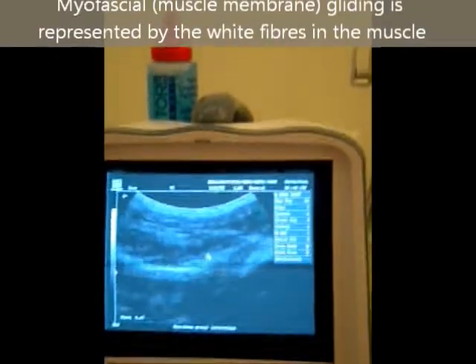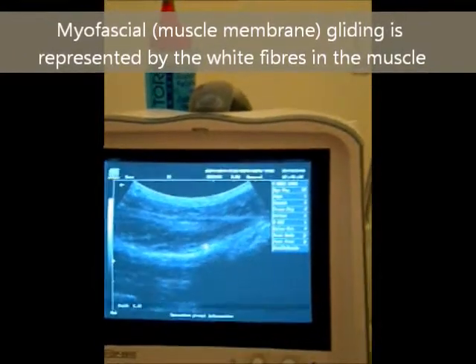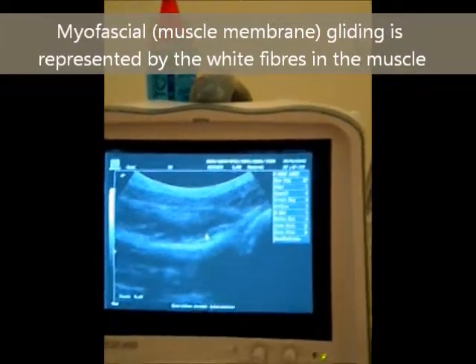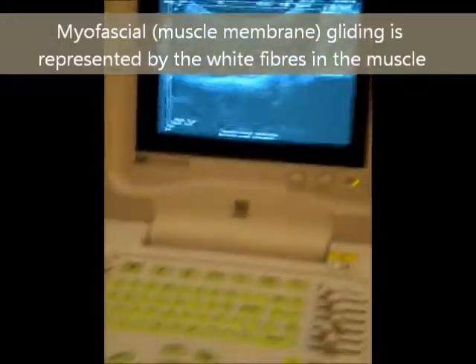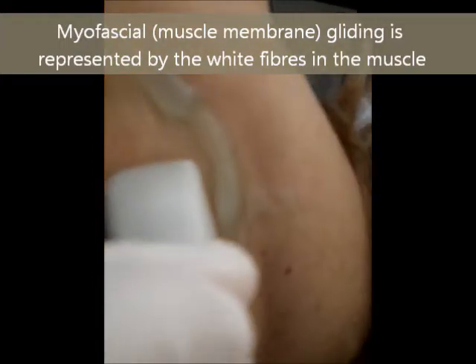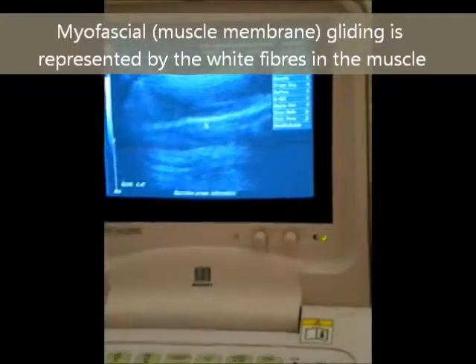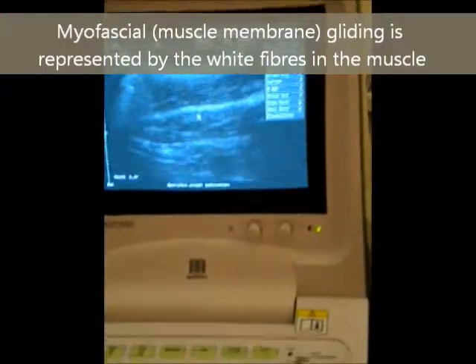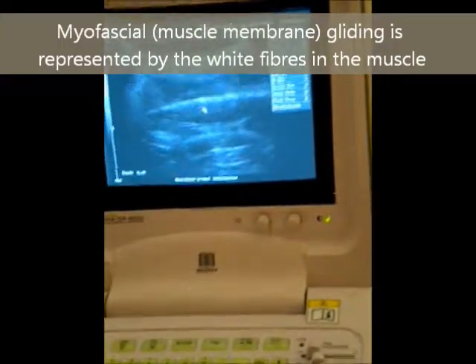To the right of the screen there, you can see the ball or the head of the humerus. And to the left, that is the infraspinatus muscle. As I take the probe further to the medial part of the shoulder, we'll actually see the infraspinatus muscle closer to its bulk at the inner edge.